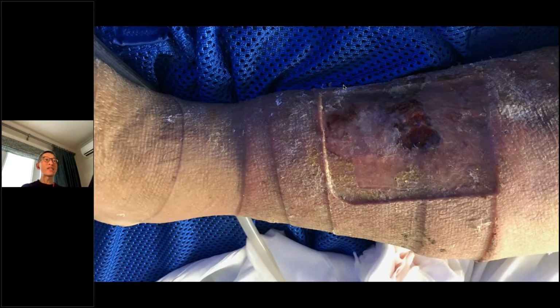If you're not convinced, think of this case. I was using a foam dressing under compression, and you can see the indentation that particular foam dressing has created on this leg. The material, especially around the foam edges, cut right into the skin, causing more damage. And so immediately I thought, well, there's a need to really address this issue.